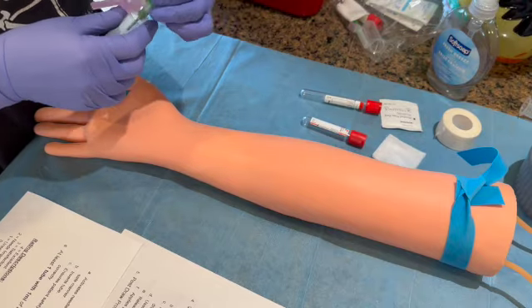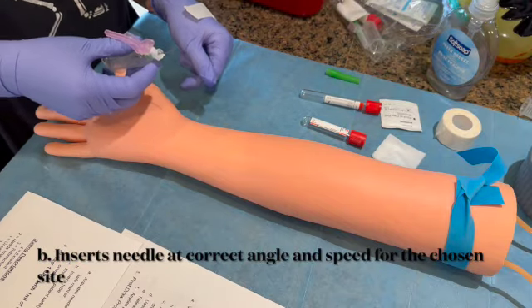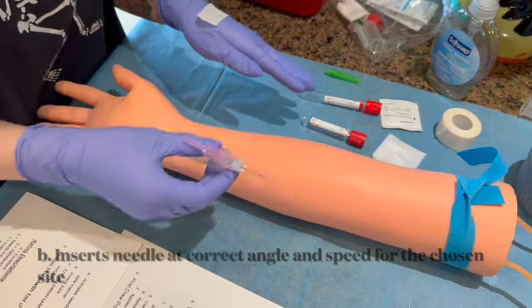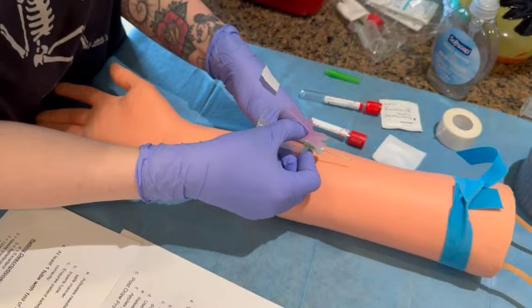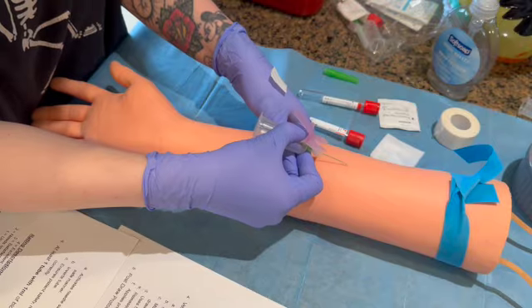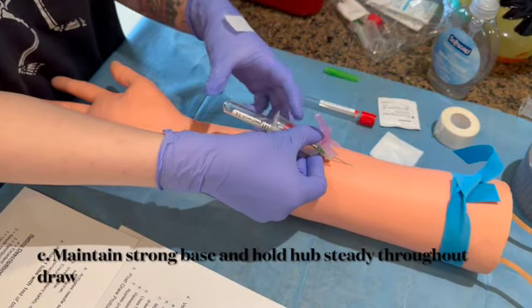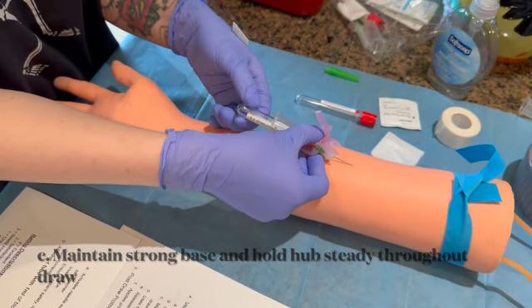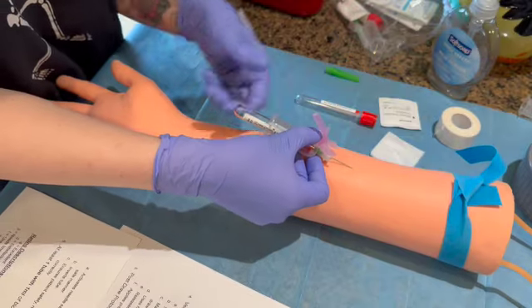We're going to then insert the needle at the correct angle and speed for that specific chosen site. And we're also going to maintain a strong base, holding through the full draw. So keeping that anchor hand ready to go. And he doesn't bleed very well, so hopefully we can get a good one here. But let's see. 3, 2, 1. And we're going to also make sure that we're using our flanges to properly access that vein. Yeah, he doesn't like bleeding very well for me. I really want to get a good one though for you guys.